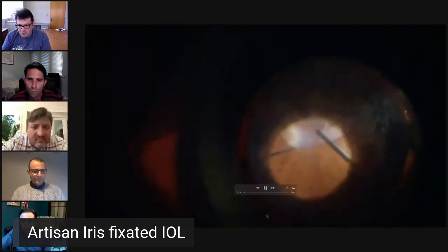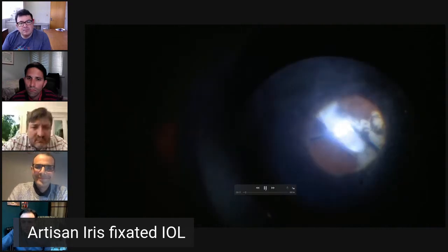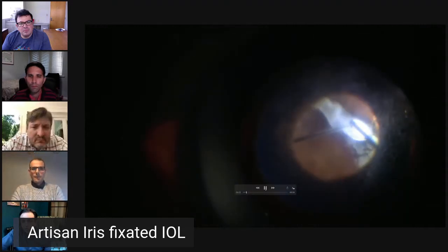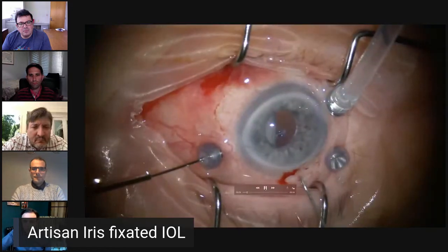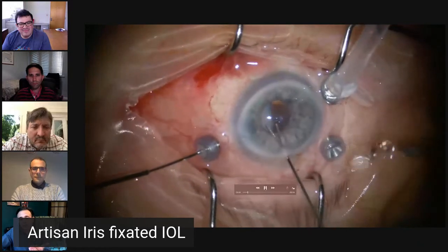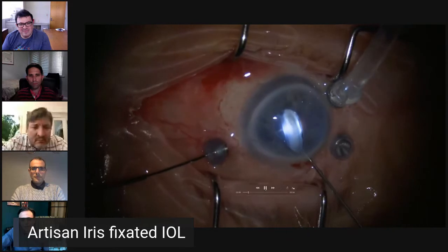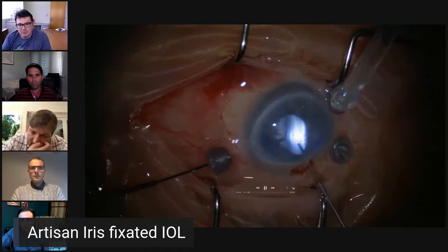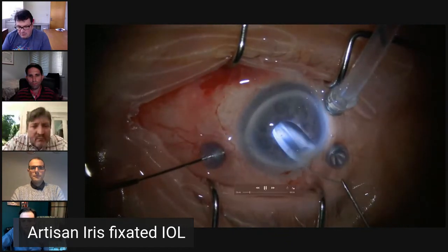Once you've lifted it with the vacuum, I do the kebab technique here, as you can see. So I'm trying to put the light pipe through the capsule. This is edited. That lens dropped once or twice before until I kebabbed it. And then you can see that you stabilize the lens a little bit in the anterior segment. And then with some forceps, these are not the long mouth forceps that I was talking about. I think this was before that era.